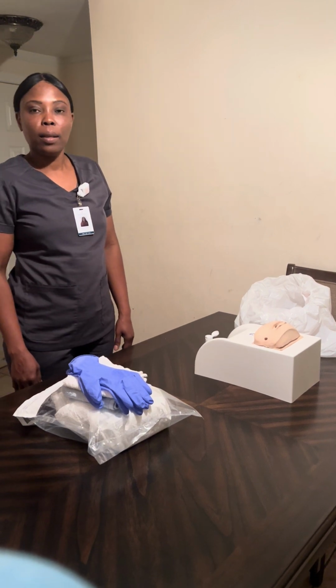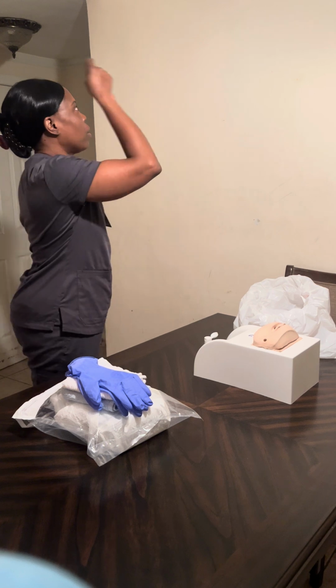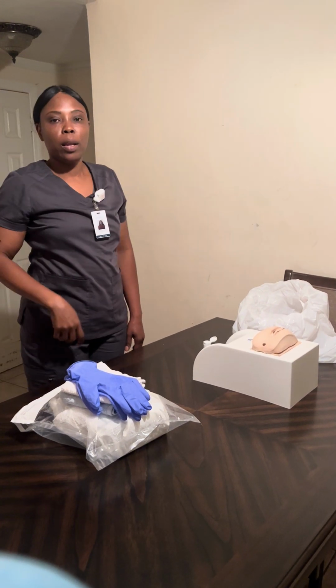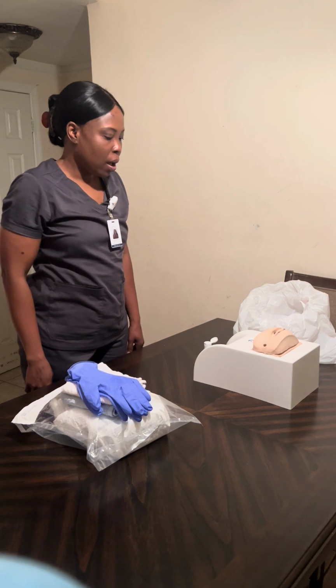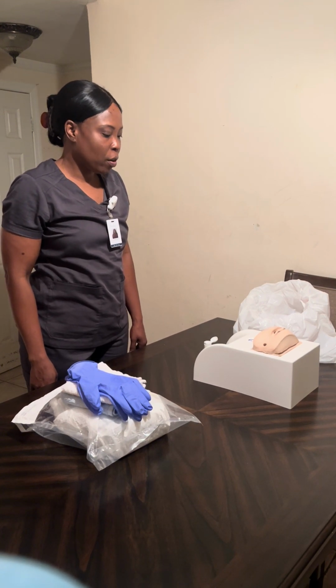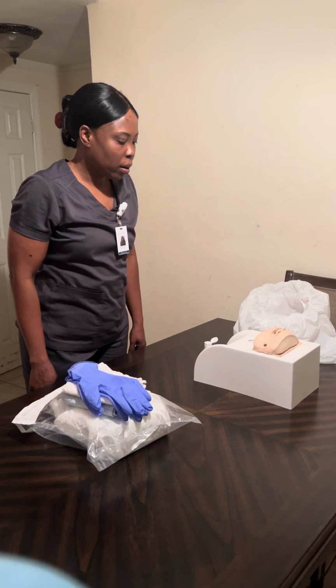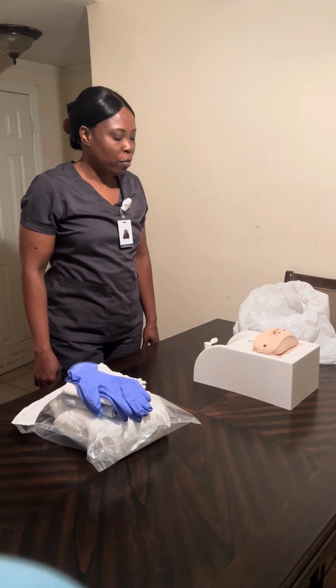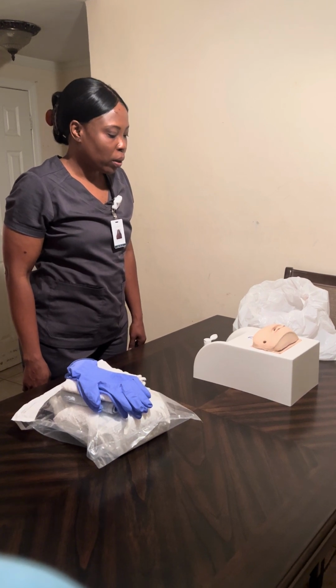First, I'm gonna knock on the door to introduce myself to my patient. Knock, knock, knock, knock. I'm gonna close the curtain behind me and then give my patient privacy. Hi, good morning. My name is Dalva. I'm gonna be your nurse today. Please, can I have your first and last name and your date of birth? Okay, can I check your waistband? Okay, today I'm gonna perform insertion catheter Foley. Is that okay with you?